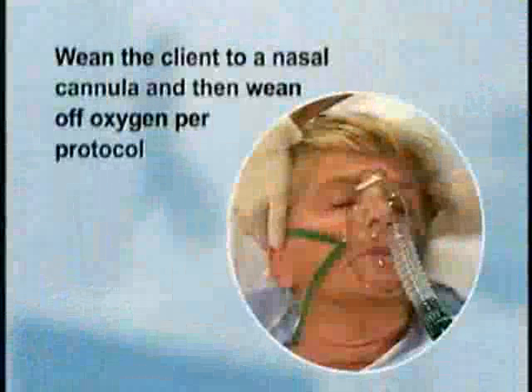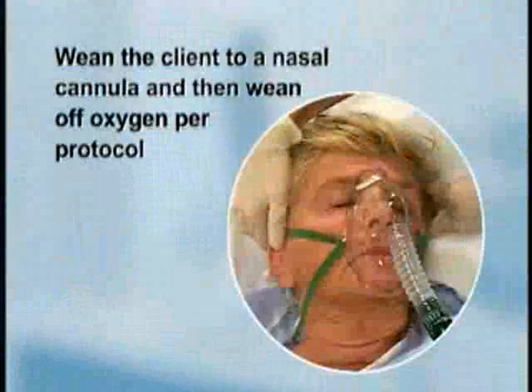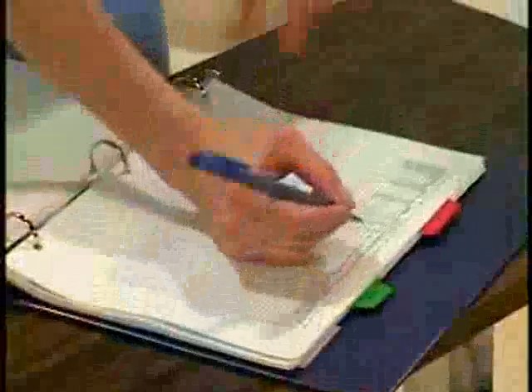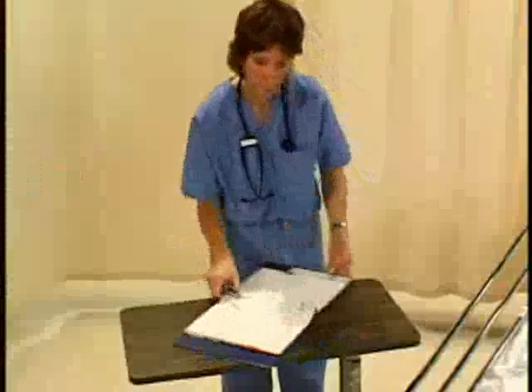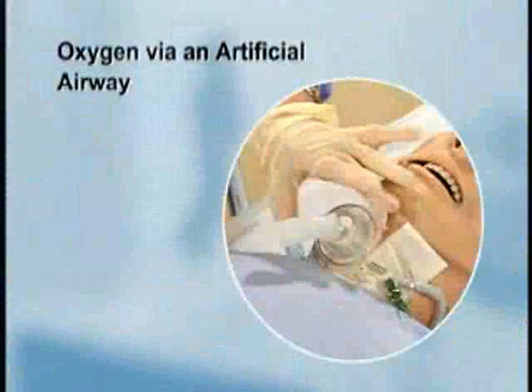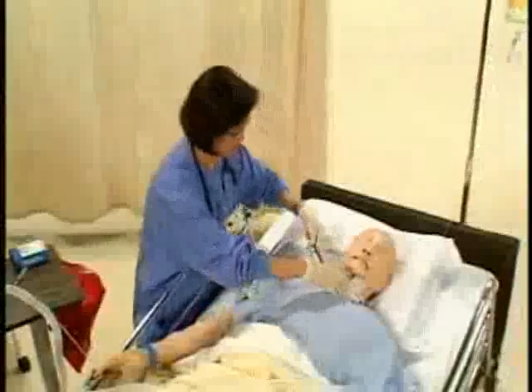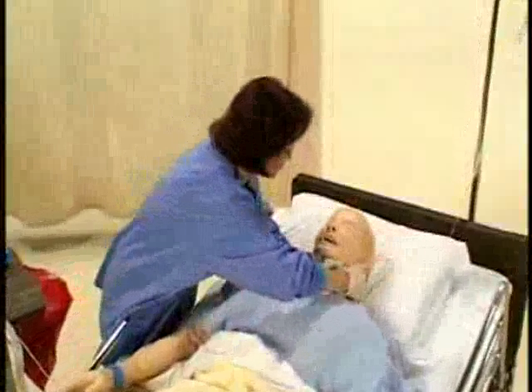Wean the client to a nasal cannula and then wean off oxygen per protocol. Remove your gloves, wash your hands, and document the administration of oxygen.